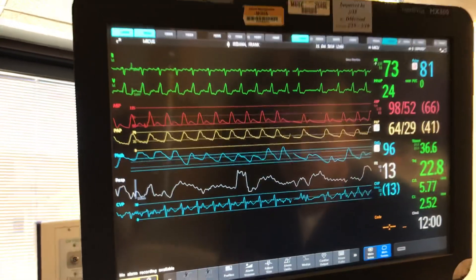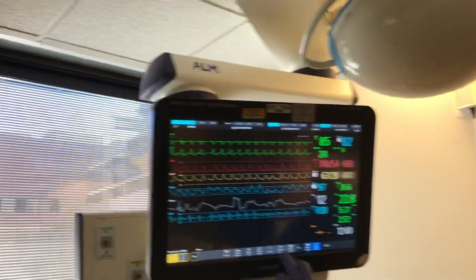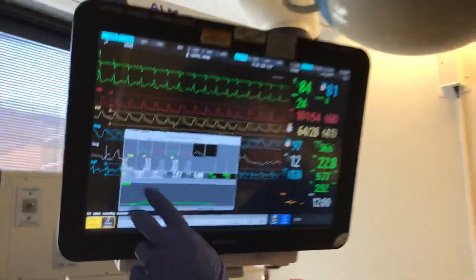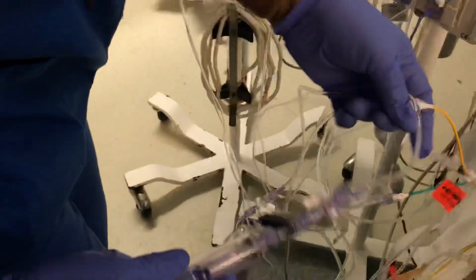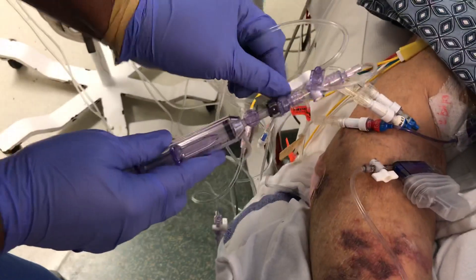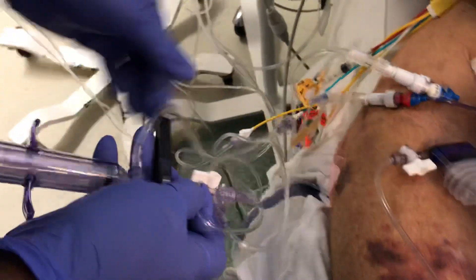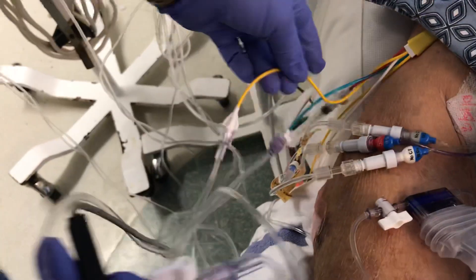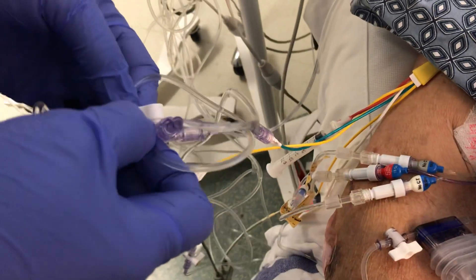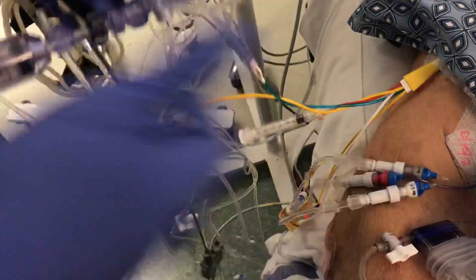So now we'll do the cardiac output. And that prints out to the printer. So this one — you go to cardiac output here. And this will bring you up to your screen and then you'll inject here. So once she's ready, you've got your D5 in a bag up there. So you'll pull to the syringe. And I'll make sure this is my proximal injectate port. So this goes to your CVP monitor line. The only thing I just wondered — they put the swan in but they used the other one.